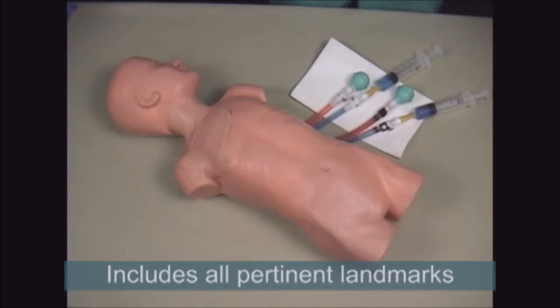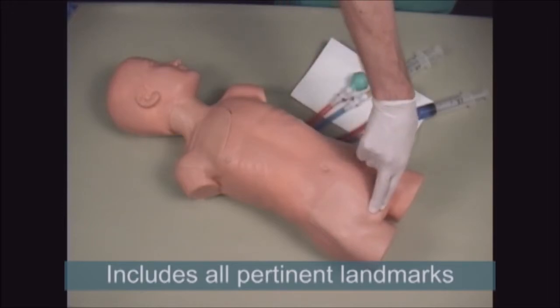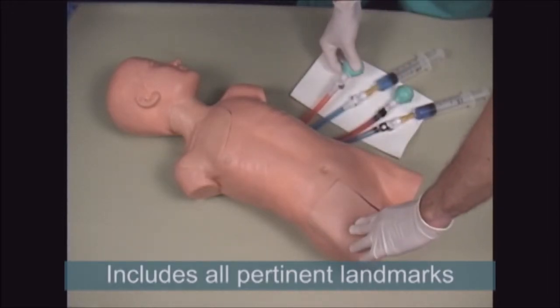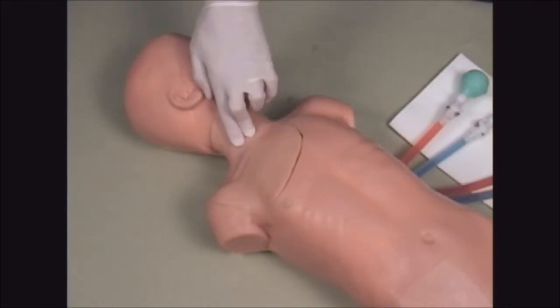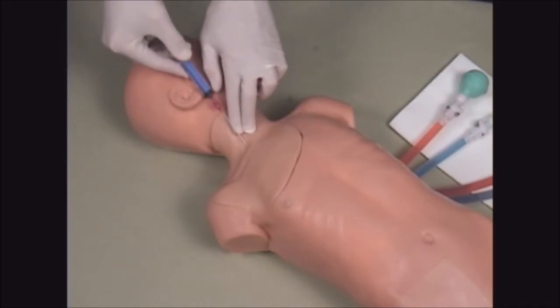For the last access site, the femoral vein, the landmarks include the anterior superior iliac spine and the pubis symphysis. The user will be able to locate the pulse of the femoral artery and the inguinal ligament. When the needle enters the vessel, the user will receive a flashback of blue venous fluid.